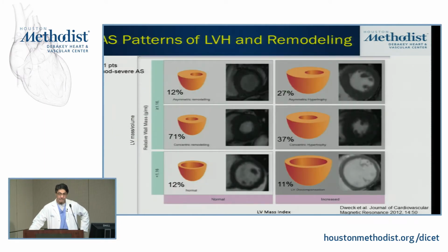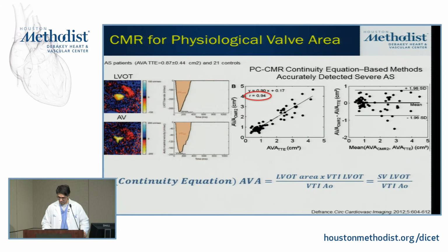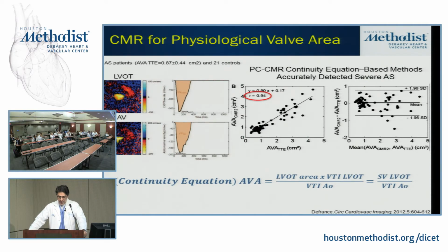Now, you tend to get a smaller number than the structural? Yeah, Dr. Q, we haven't been doing it. We don't routinely do it here in our lab, only because of the way we've been performing our measurements.